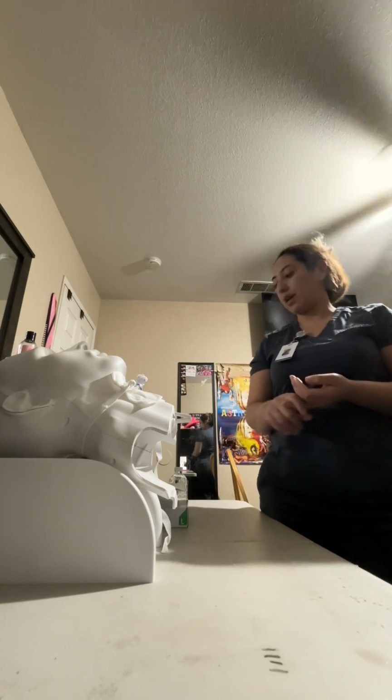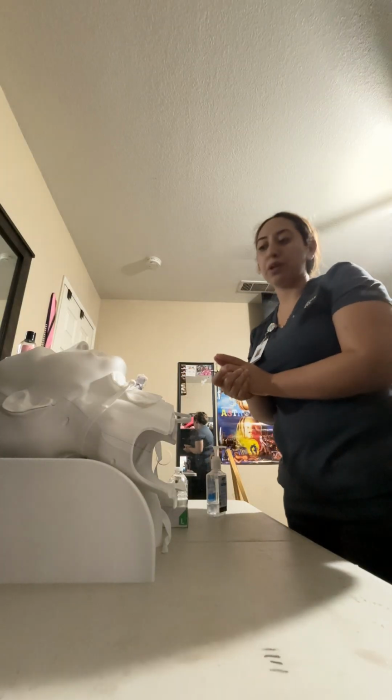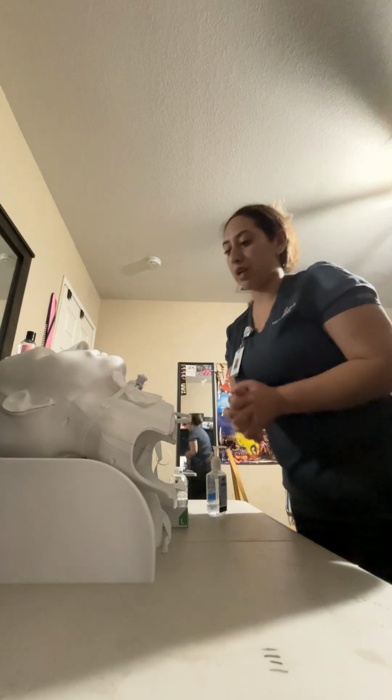So at this time, I am going to hand wash. Going to introduce myself. Hi, my name is Mariah. I'm going to be your nurse today. I'm going to go ahead and close the curtain behind me and provide us some privacy. I'm going to ask you to verify your name and your date of birth.